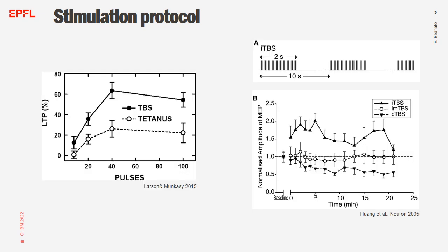So, we now know that we want to target the striatum in the context of motor learning. As a next step, it is important to define which kind of protocol can be used to modulate striatal activity and how. To reply to the first question, the choice was made to use a well-established protocol mainly used in the TMS domain, the theta burst stimulation. Theta burst stimulation, TBS, demonstrated the ability of inducing brain plasticity, and in particular, one of the protocols originally introduced in humans showing plasticity modulation is the intermittent theta burst stimulation.